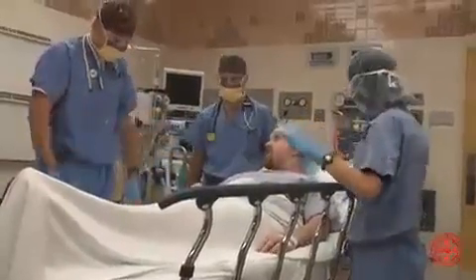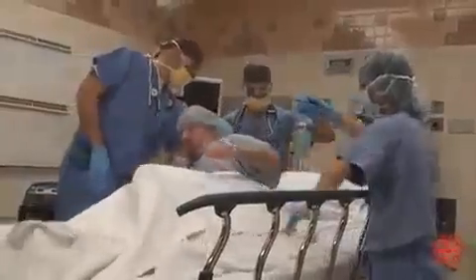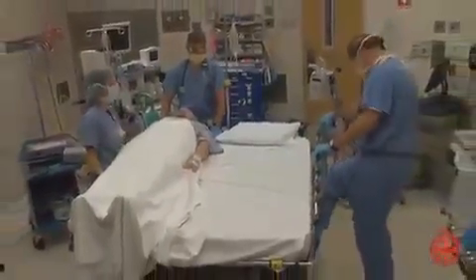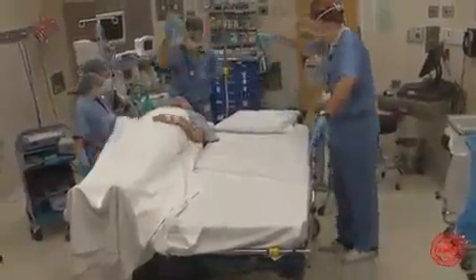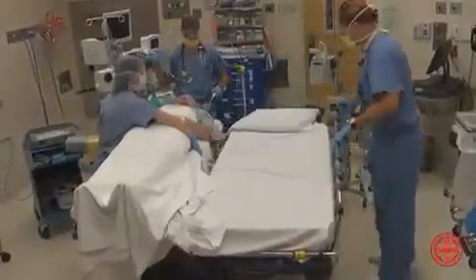A critical step is to transfer the patient from stretcher to operating table. To avoid accidental falls, which may lead to serious complications, both the stretcher and the table must be locked in position. Here, good communication is imperative. There should always be at least one person standing next to the stretcher and another next to the operating table, not only to assist in moving the patient, but also to minimize the possibility of an accidental fall.